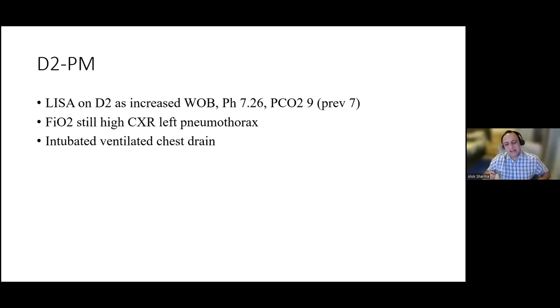The question that I'd be asking is whether you might have had a pneumothorax, which led to the deterioration before you did the surfactant. That would be a really good point. And this is a beautiful case, Naz, in that any kind of acute changes or deteriorations should be a trigger, but well done. Yeah, it's actually slightly embarrassing because... No, this is how we learn.